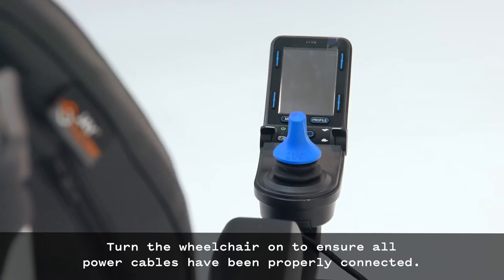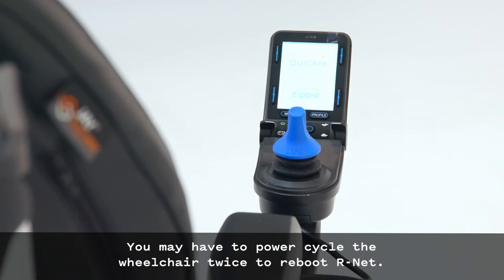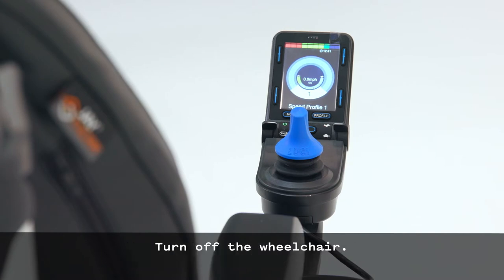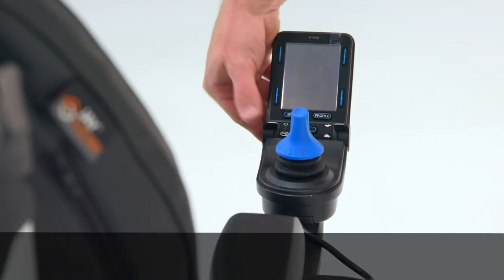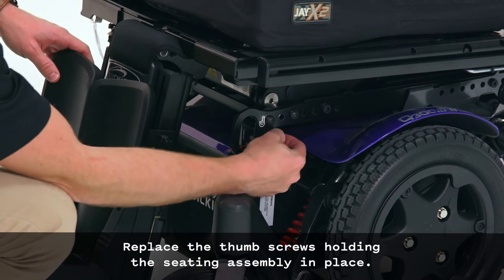Turn the wheelchair on to ensure all power cables have been properly connected. You may have to power cycle the wheelchair twice to reboot R-Net. Turn off the wheelchair, then replace the thumb screws holding the seating assembly in place.